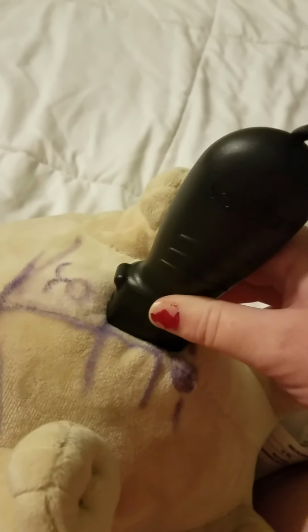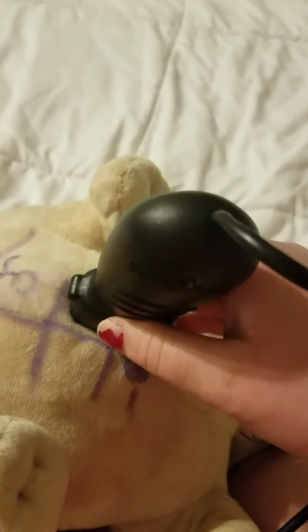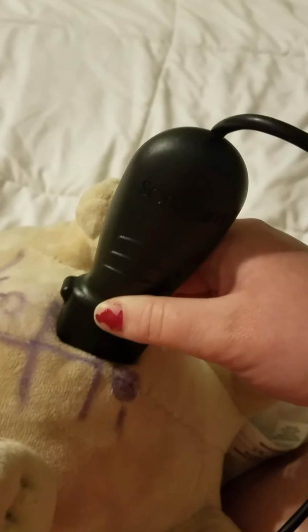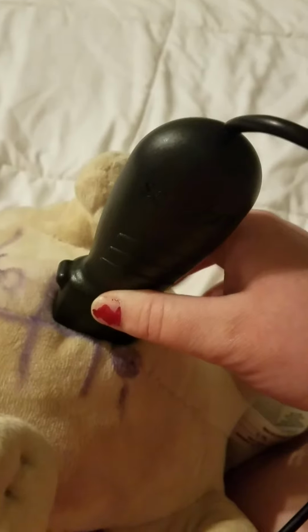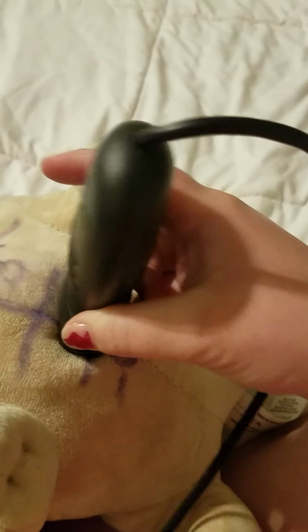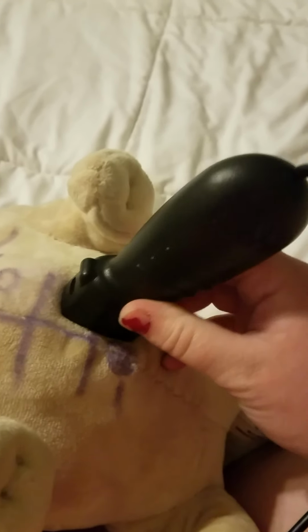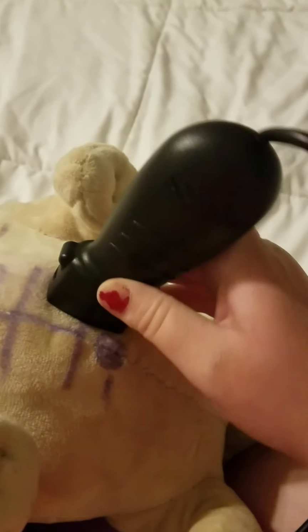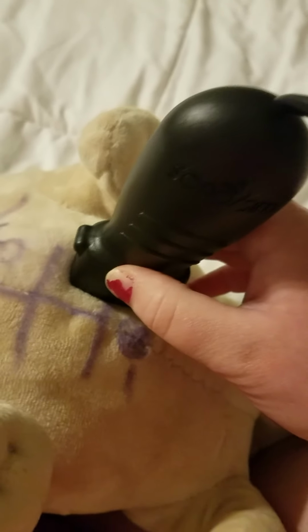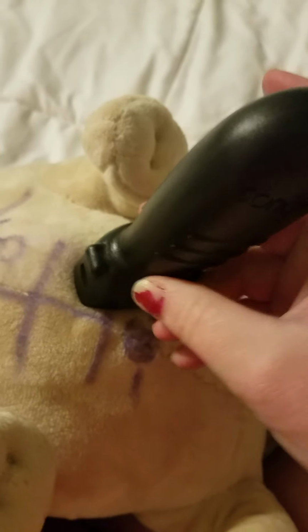You're still going to see your SMA when you're in your distal, but it's going to be much farther down the road. So then you're going to be down here by your distal. This is all opposite, so I'm going to kind of go in the wrong direction. So you're at long here, and you're at distal. You're going to take long. Then you're going to do short. You're going to do your caliper measurements for your short axis from anterior to posterior. Switch it back up to long. Then you're going to put your pulse wave through there, and you're going to look at your waveform, which is going to be a little more like your lower extremity exams. That's what your waveform is going to look like now that you're farther down this way.